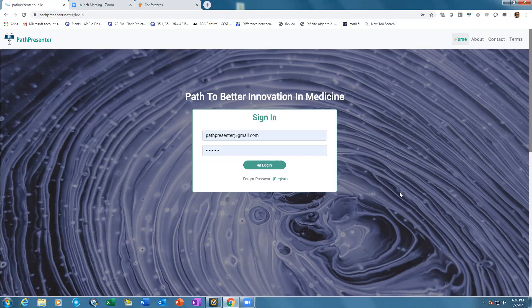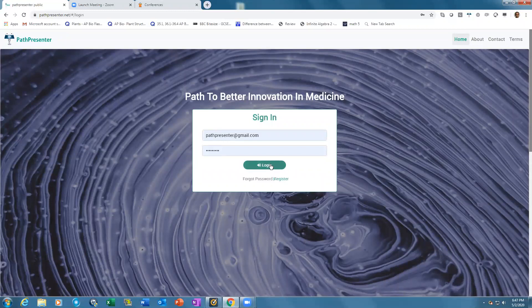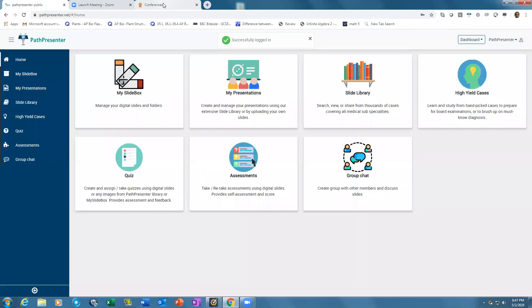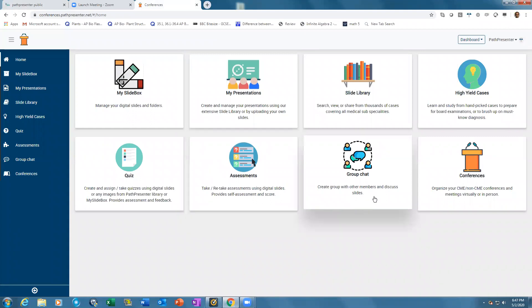Let us walk you through the easy-to-use tools and how you can transform yourself and your department into an education powerhouse. Go to pathpresenter.net - registration is free. Once you login, you'll see a dashboard showing all the different tools you can use in pathology.